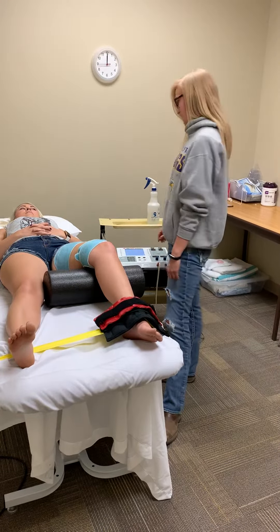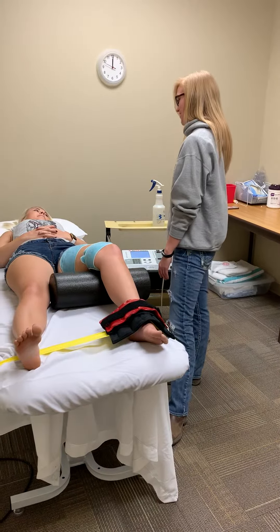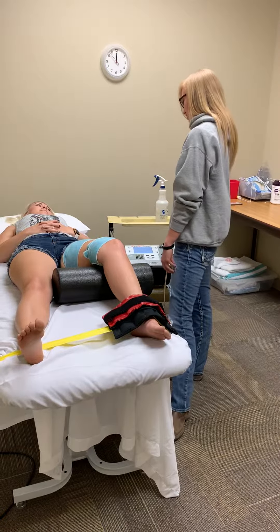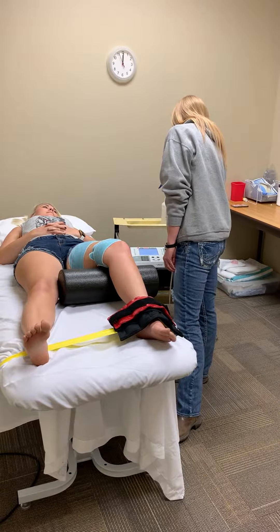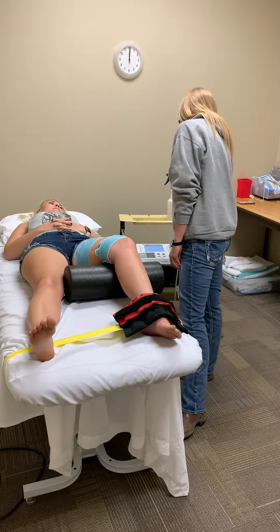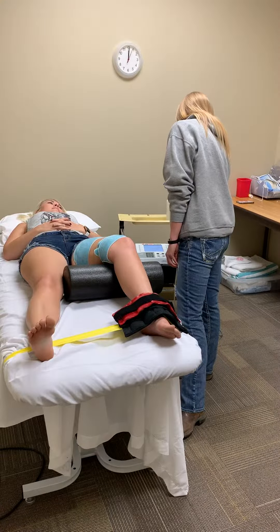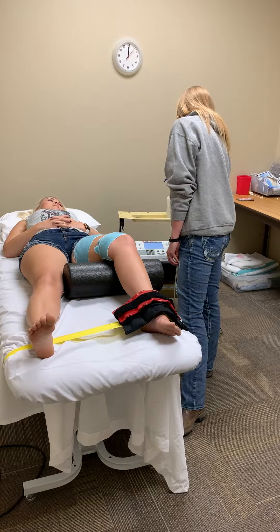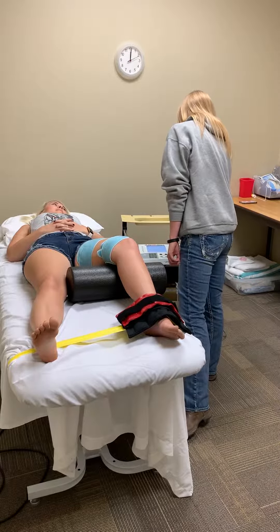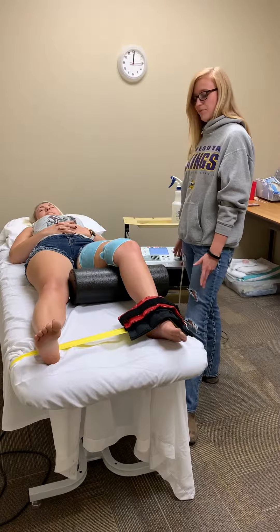We're just going to start and go from there. I'm going to explain to her that first she's going to feel a sensation and then a grabbing feeling, but none of it should be painful. Just let me know when you feel the sensation and when you feel the grabbing, and then we'll start the treatment. We'll go for approximately 10 minutes.